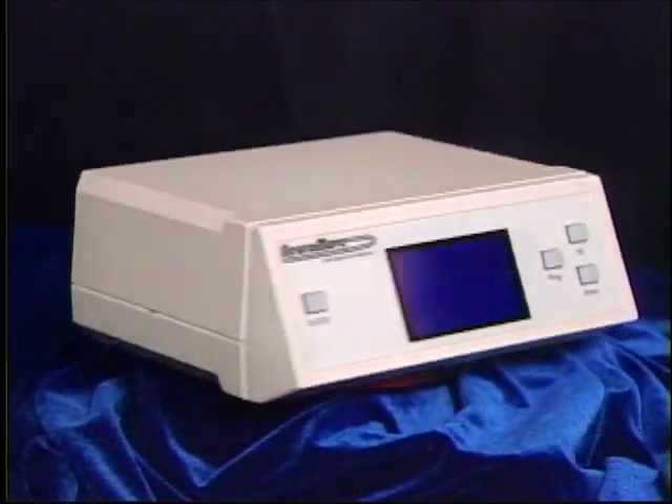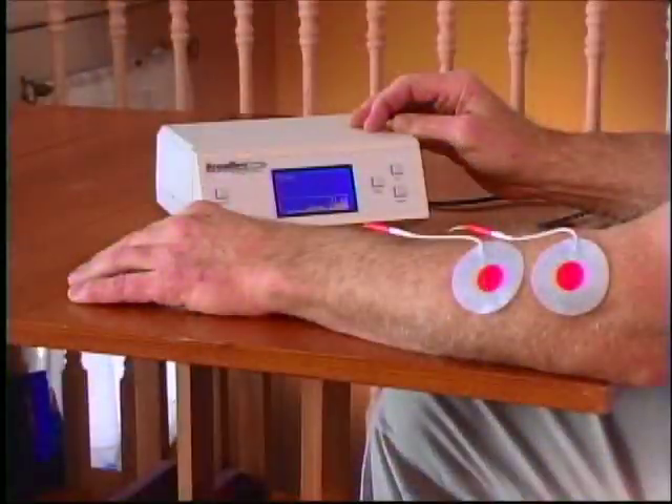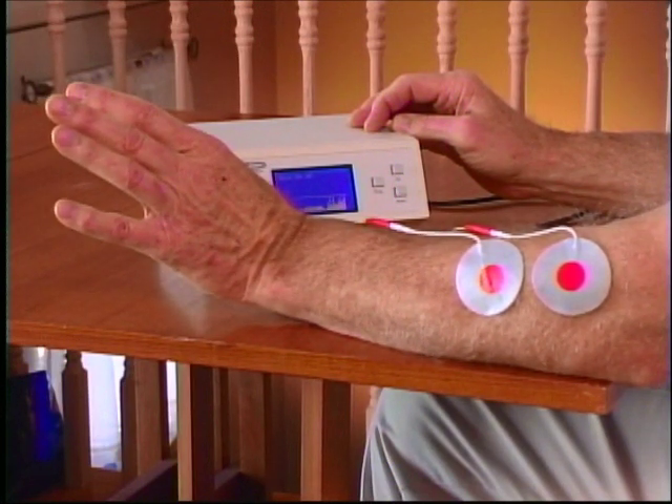NeuroMove retrains your brain using a process called EMG-triggered biofeedback. That means the NeuroMove detects your brain's attempt to move an affected muscle group. When it does, it rewards that attempt with a few seconds of muscle contraction and sensory feedback.